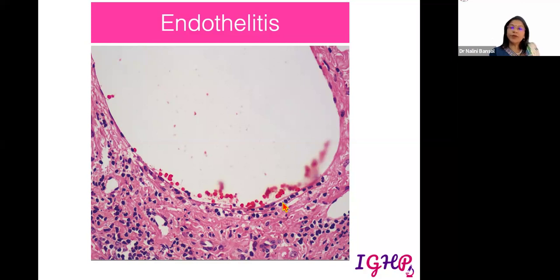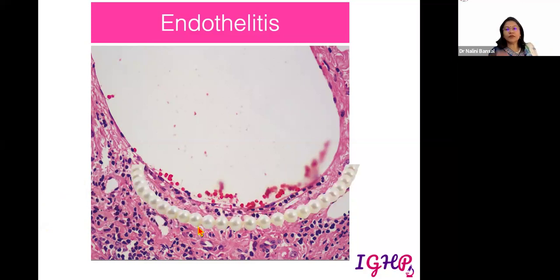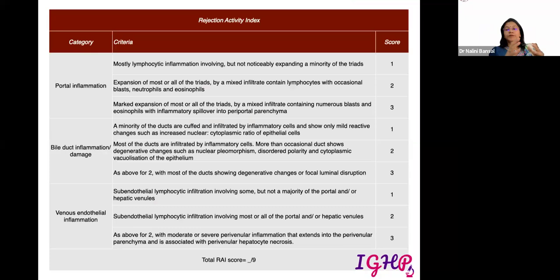So this will be accompanied by endothelial cell damage, and that could be in the form of swelling of the endothelial cell, enlargement of these endothelial cells, and later on the upliftment and loss of the endothelial nucleus. So this is how the cells are going to come and sit beneath the endothelial cells, and this is also known as a string of pearl appearance, similar to the pearls in a garland. Likewise, we would see the lymphocytes coming and sitting beneath the endothelial cells. So this is what is known as endothelitis. It can occur in few or most of the vessel walls.